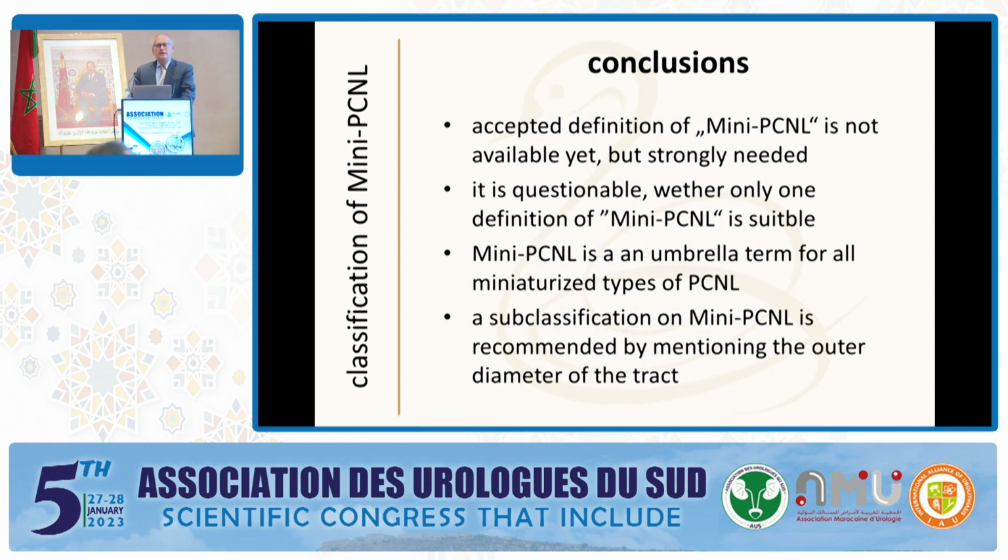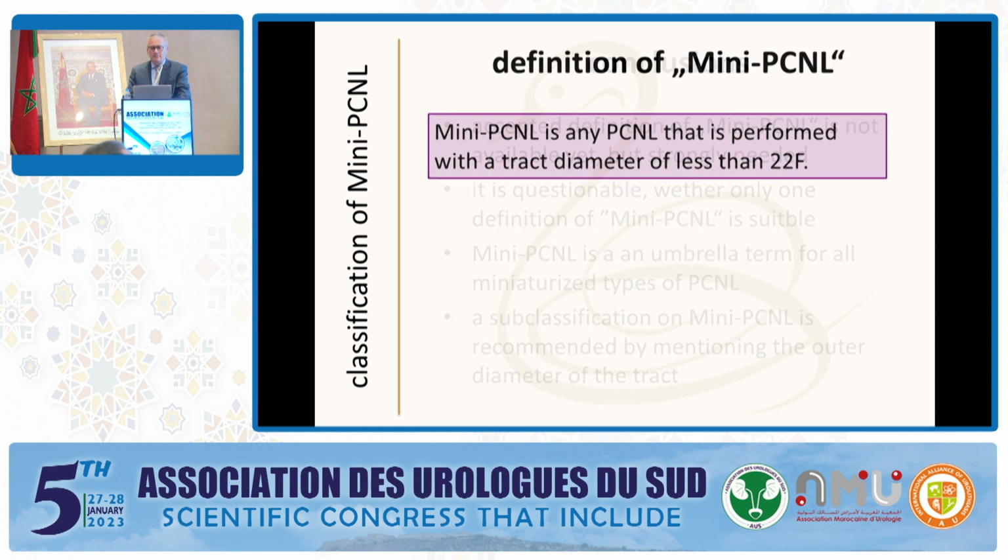What we need is an accepted definition of mini PCNL, which is not available yet, but this is really strongly needed. And it is questionable whether only one definition of mini PCNL is suitable. Mini PCNL is a so-called umbrella term for all miniaturized types of PCNL. And a sub-classification of mini PCNL is recommended by mentioning the outer diameter of the tract.